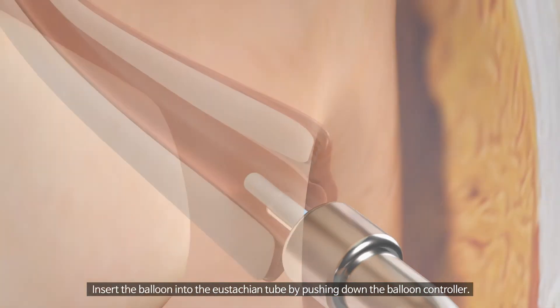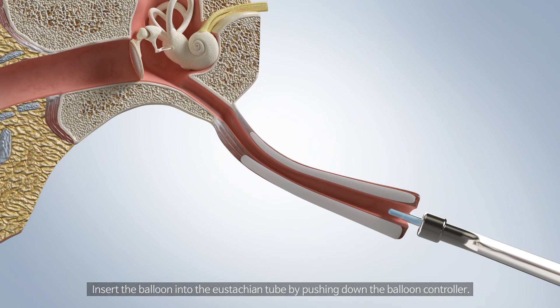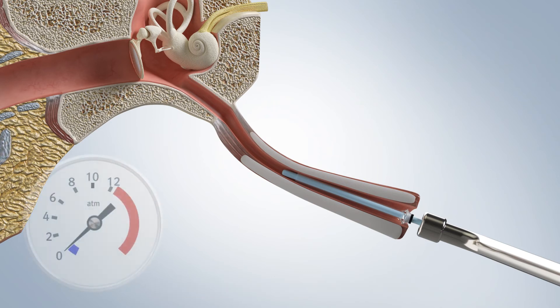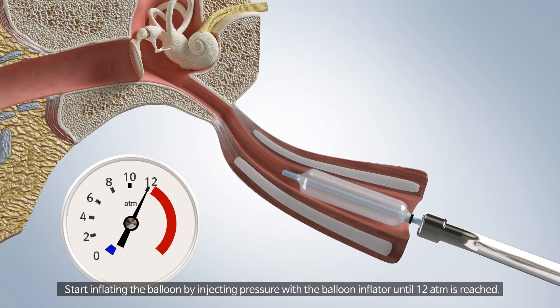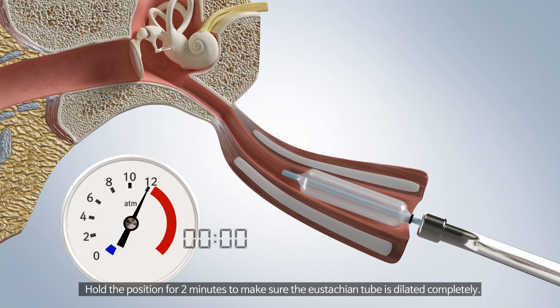Insert the balloon into the Eustachian tube by pushing down the balloon controller. Keep inserting the balloon until you see the black mark. Start inflating the balloon by injecting pressure with the balloon inflator until 12 ATM is reached. Hold the position for 2 minutes to make sure the Eustachian tube is dilated completely.